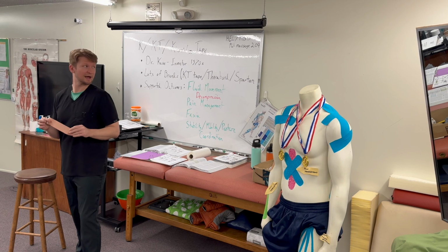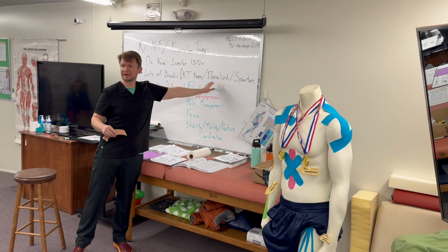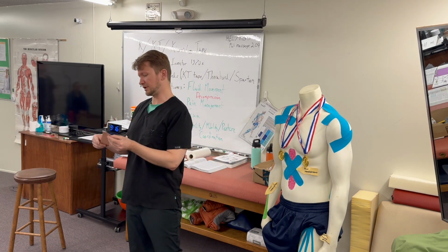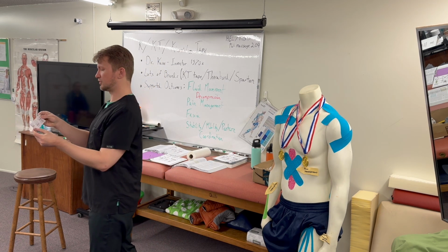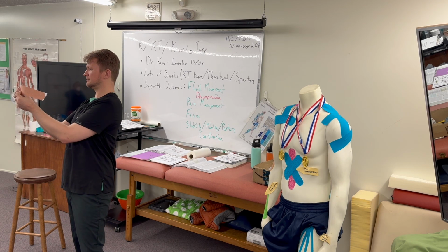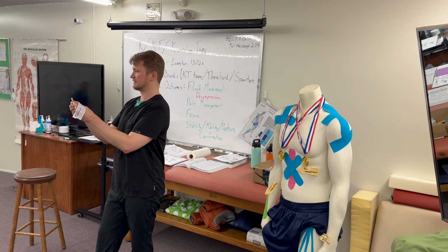The brand you have is TheraBand, and the reason why this one is just good from an instructional standpoint is when I turn it over, it has this cool kind of reptile skin pattern on it with these hexagons.